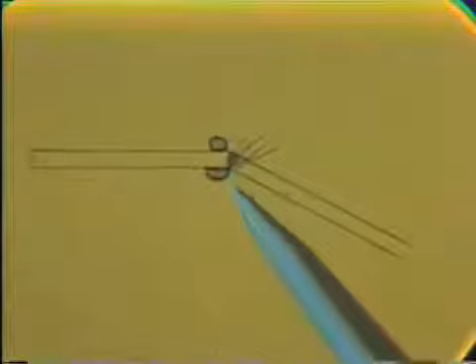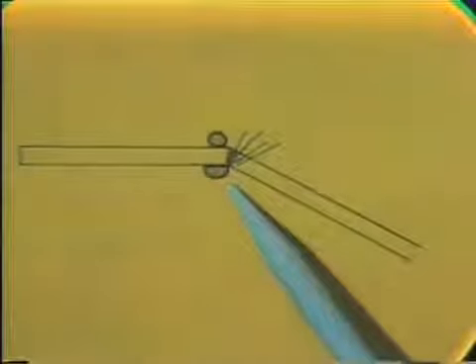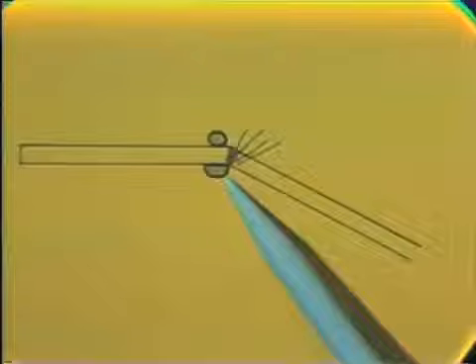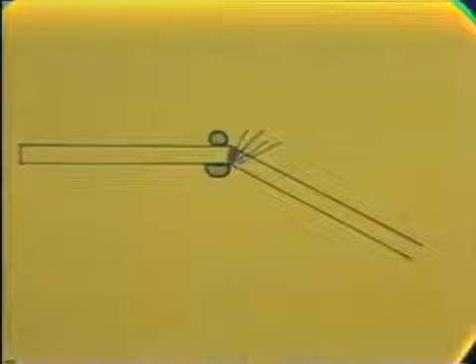There are some problems that should be avoided in wire bending. The first of those problems is damage to the wire from plier manipulation. I'm speaking about gouges or nicks in a wire that are placed in it and may weaken it. Now, you never should bend a wire over the flat beak of a 139 plier. Always bend a wire over the round beak of a 139 plier.